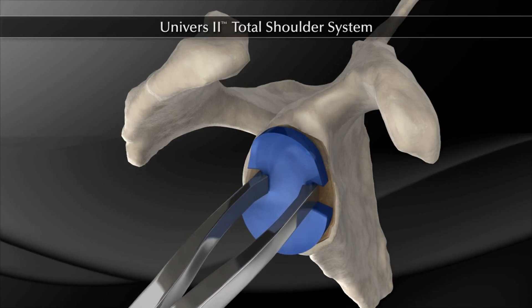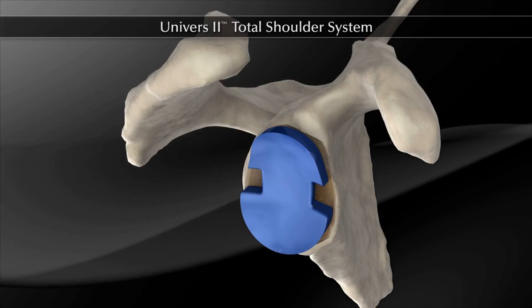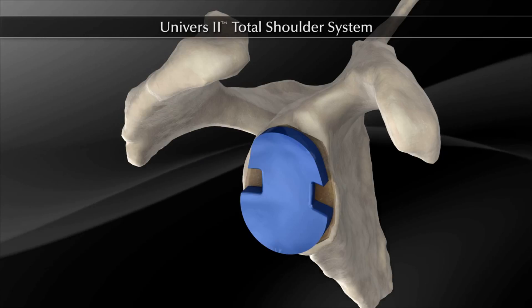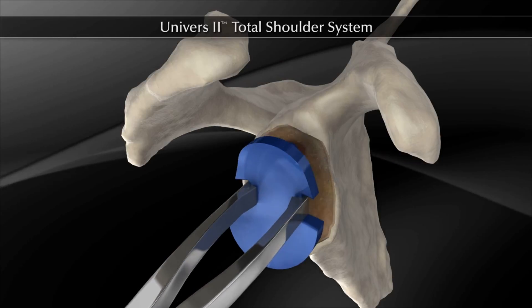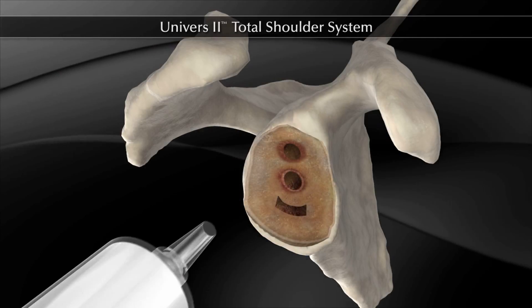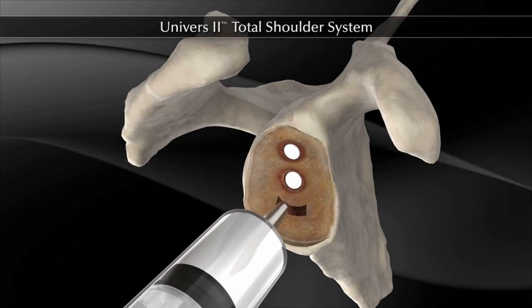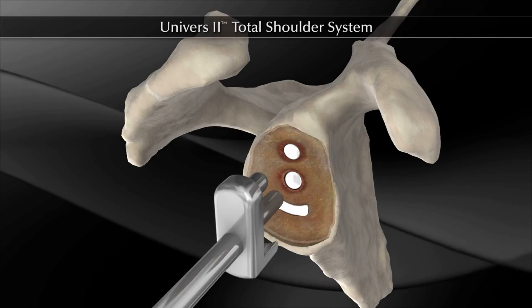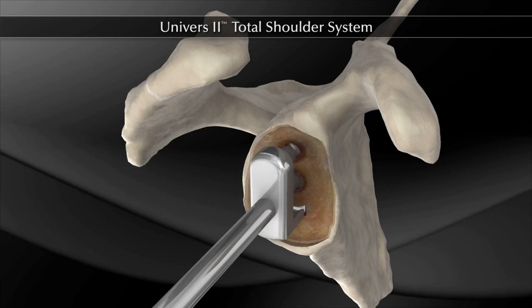The trial glenoid of appropriate size is inserted. Verify that the trial is fully seated against the glenoid surface to ensure proper fit of the actual glenoid implant. The glenoid trial can now be removed with the trial forceps. Once the glenoid has been fully prepared, the keel slot and peg drill holes are packed with cement using a syringe or finger. The pressurizer tool is pushed by hand into the glenoid to pressurize cement into the prepared keel slot and peg holes.